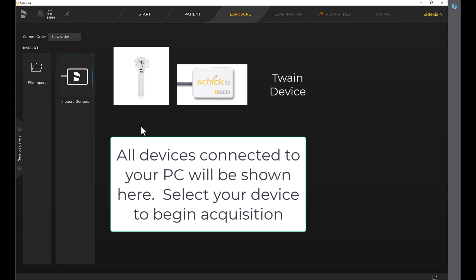All devices connected to your PC will be shown here. Select your device to begin acquisition.